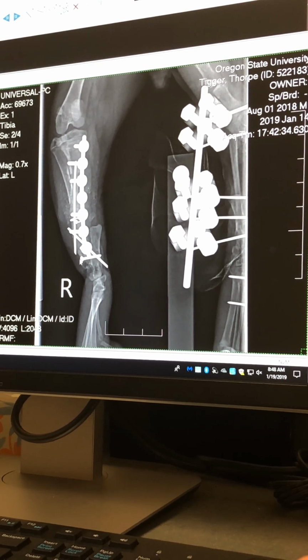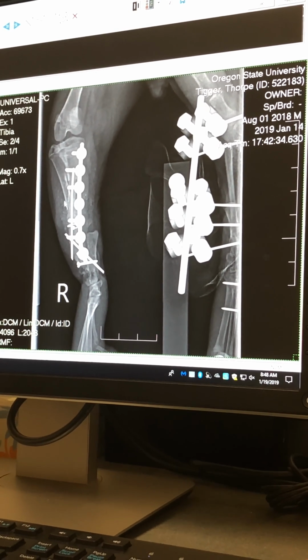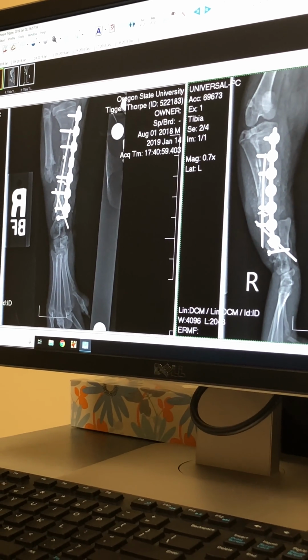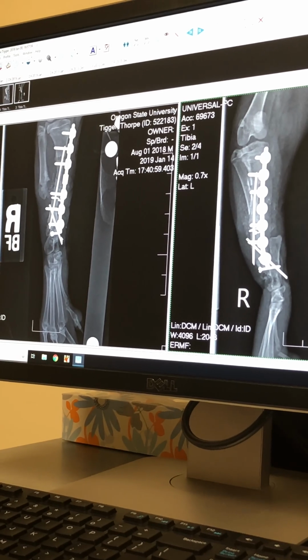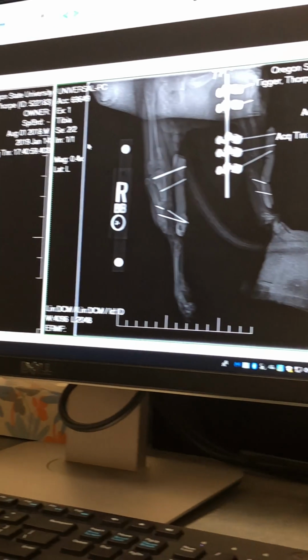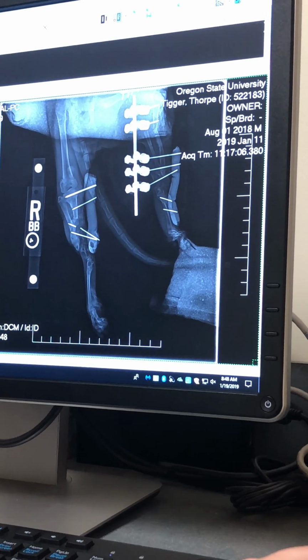You can see the little baby screw coming this way and the pin coming this way. So our goal is for this bone to heal, which you can see is really well aligned right here where we fused them together, and then have the ankle be strong too. The only problem is that we are worried about, let me show you more of these post-operative x-rays.